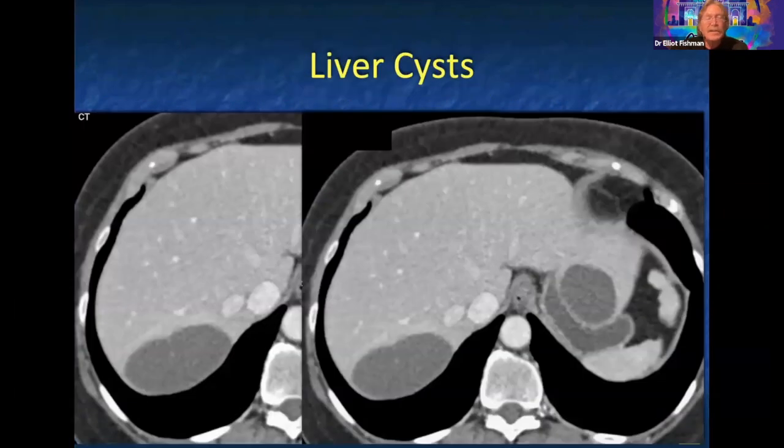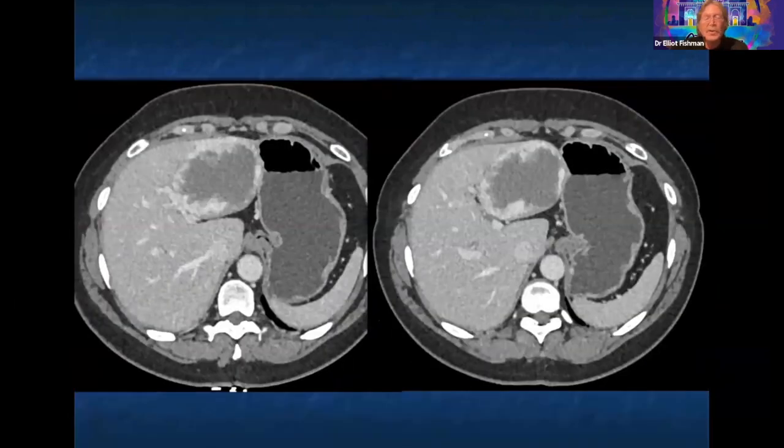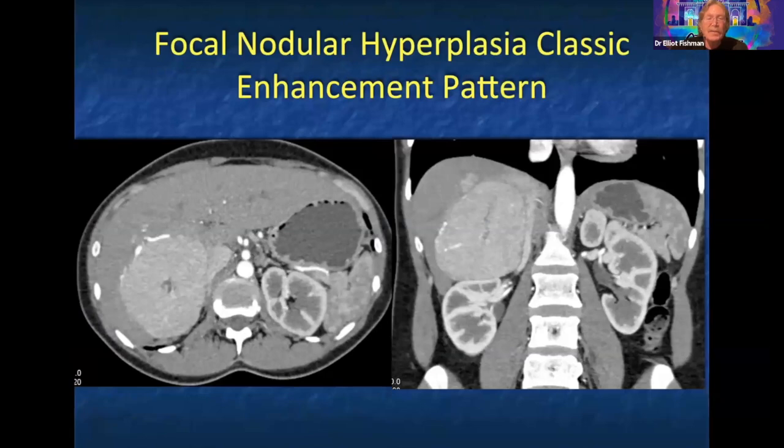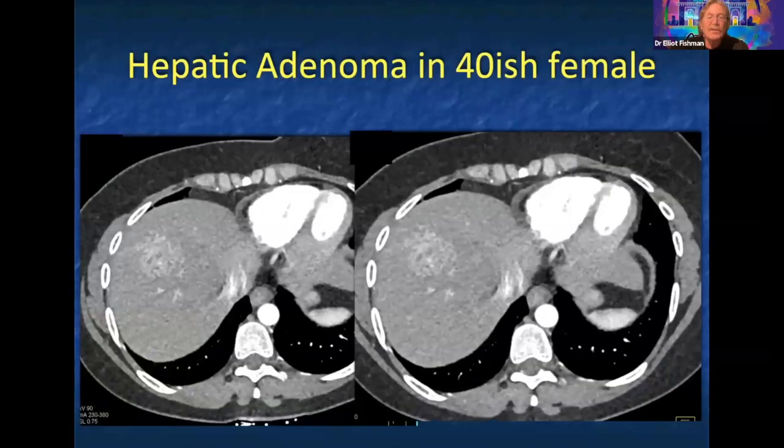patients. Simple incidental lesions in the liver, that's a cyst, that's a hemangioma. There's no need to work things up when they have classic appearances. We talk about FNH with that homogeneous enhancement like the IVC, but not the aorta, the central scar, the feeding vessels, and the way the lesion gets filling in. I think it's important to have really close interaction with the radiologist and the technologist. In many cases, the ability to get an extra sequence at the time of the scan will allow you to make a very specific diagnosis.